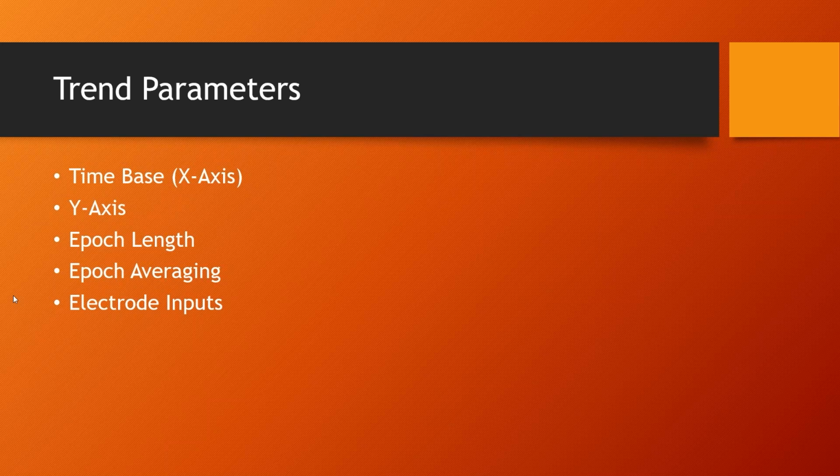Then you get that morphology information, you get that phase information, all of which kind of completes the picture of what's really going on. The trends are kind of giving that big picture overview. Does that answer the question? Any other questions?